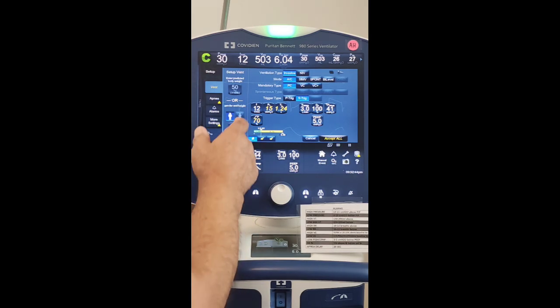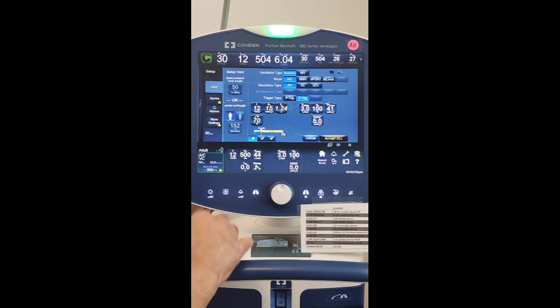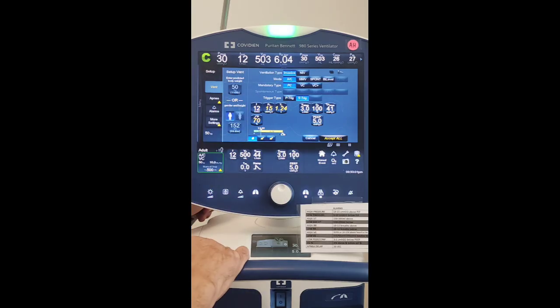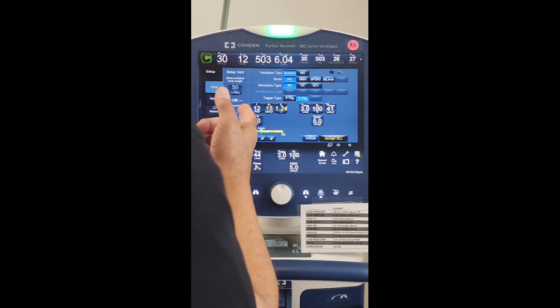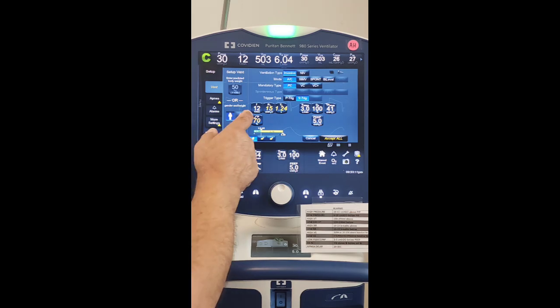Okay, and then this one also has a new display here. It looks like a little slope with a P, and it's a percentage. This is slope, or some places call it a ramp, or there's another term which I didn't quite get here, but anyways, it's another term for it. And anyhow, we're going to leave it at a default of 70%.